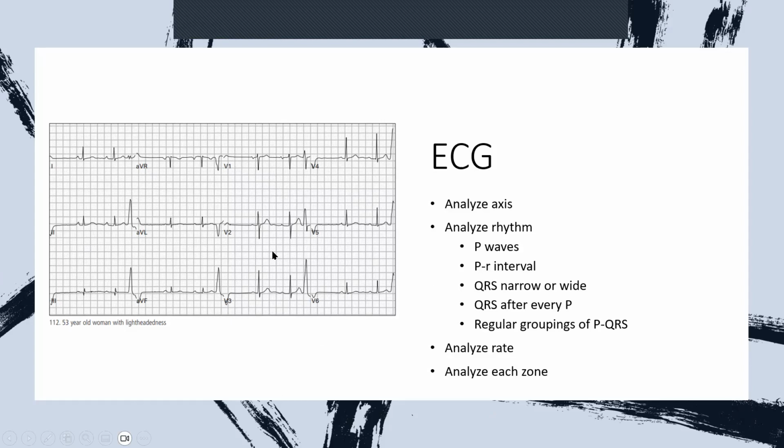Now, if you're confused or if you don't understand any of that, have you guys got access to the learning group? No. And online? Okay, I'll show it to you all after this. There's a whole series of lectures on the ECG basics. Okay. So let's go through this ECG then.